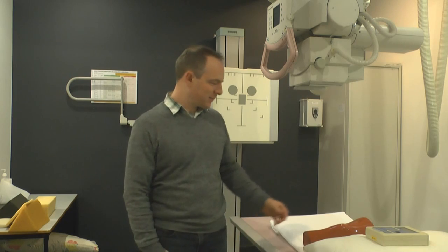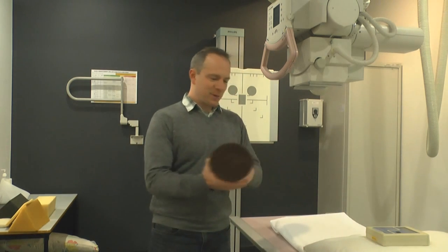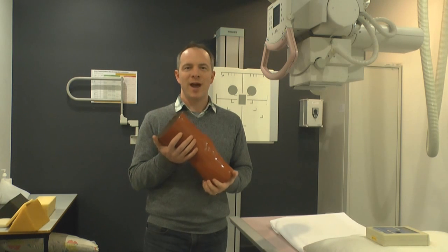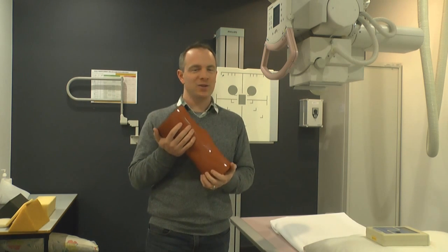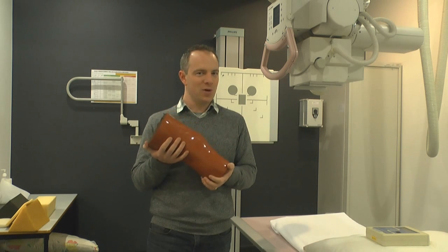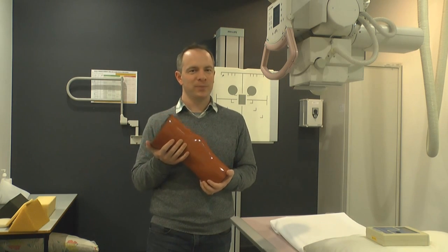Marcus Kitchen and I'm going to be talking to you about the imaging practicum that we're going to be looking at today. And we're going to be focusing on imaging the knee phantom. And we're going to be looking at what happens when you change the mAs, that's the tube current, and the kilovoltage, that's the kVp, and what happens to the image quality and also to the dose as well.